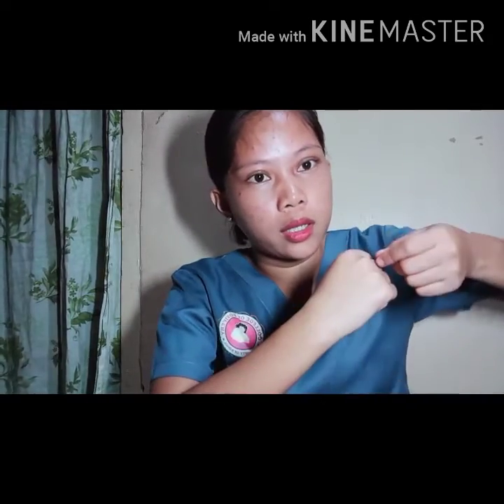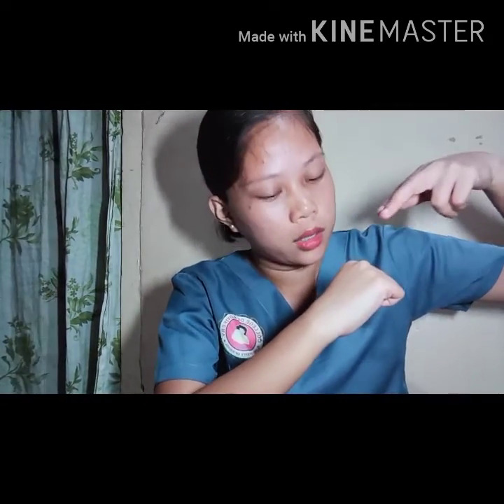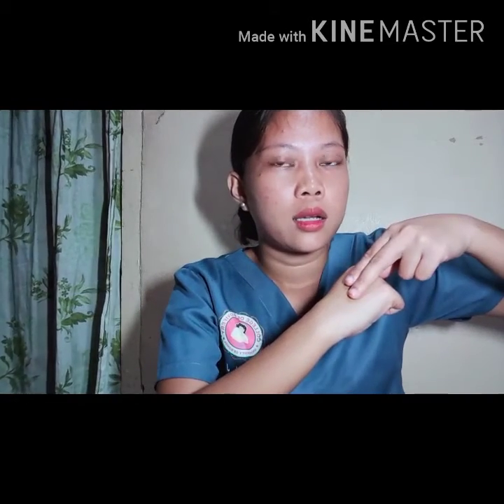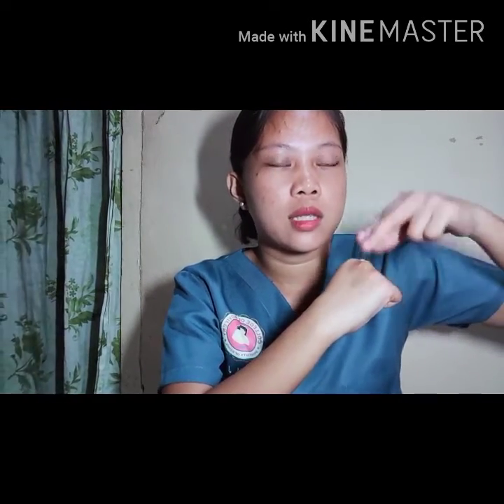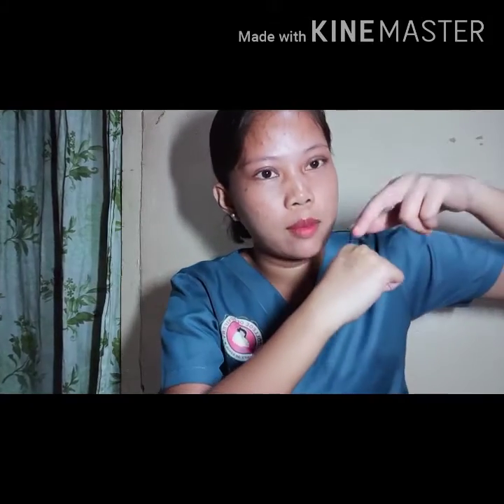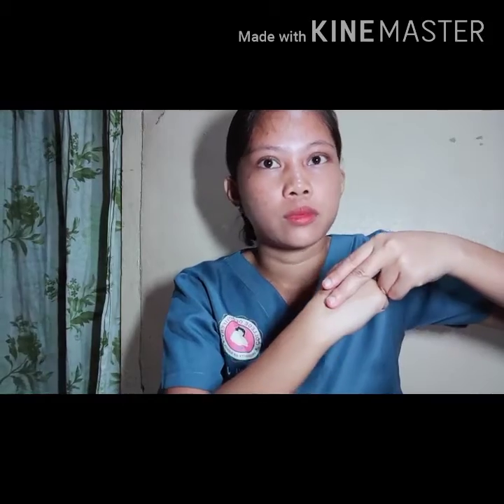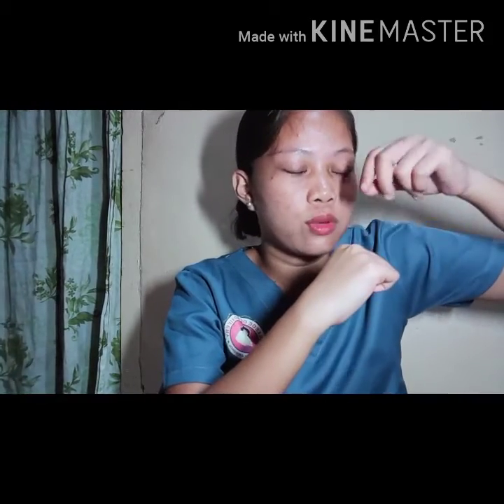So imagine nga nakatusok na ka and nakahit na kag vein, so suddenly lack of resistance is felt as needle enters the vein. So maka-feel man na nimo kung sa ugat pa nimo nasud or wala ka kasud. So kay kung makasud nimo, smooth ra jud ang dagan sa needle. Kung wala, rough na siya, murag hagashas kay murag naa ka sa muscle na nakahit.